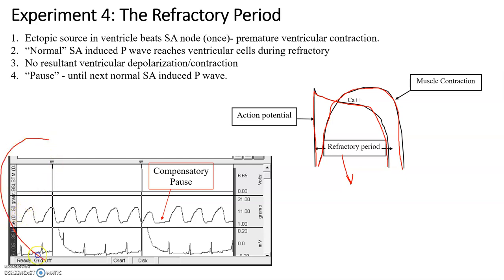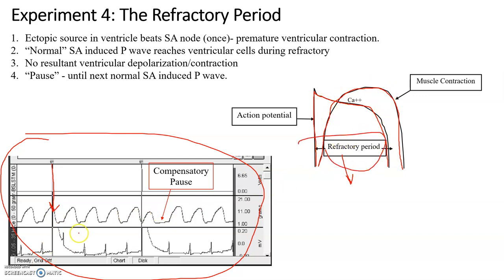So if you look at this diagram down here, we notice we have this rhythmic beating, and we're going to stimulate the heart. And so the first stimulation in this data comes right here, and notice it's during the contraction of the ventricles, and because it's during that contraction period, it's also during the refractory period, and even though we stimulated, the heartbeat continues on normally.